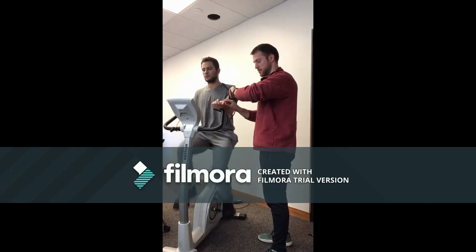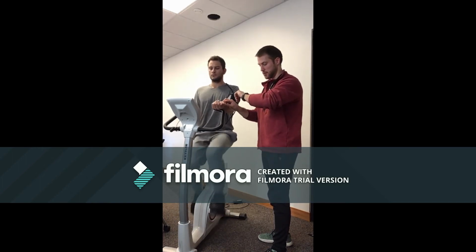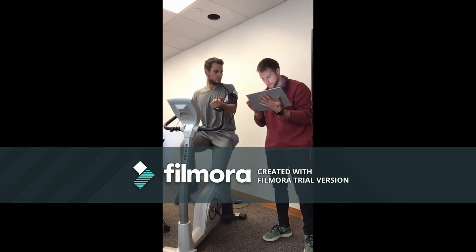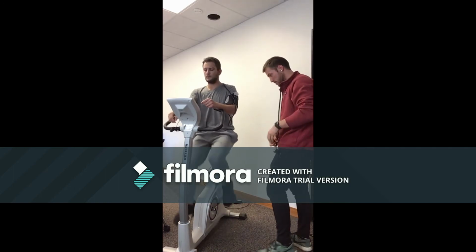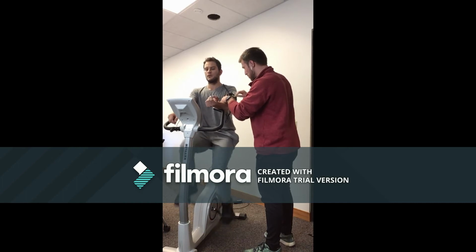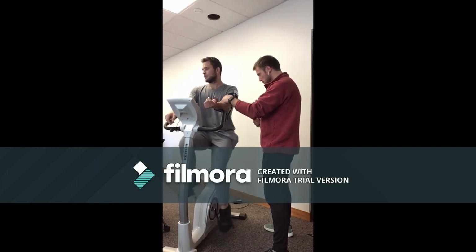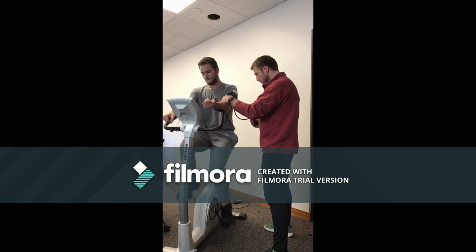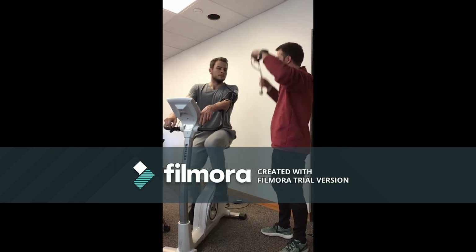Take your pulse. Right, awesome. So I got on that one, same thing as I did last time, you got 140. And let's take your blood pressure again, you're doing awesome. Thank you. Okay. Where would you say you are right now on that scale, that RPE? I'd say I'm still 14.